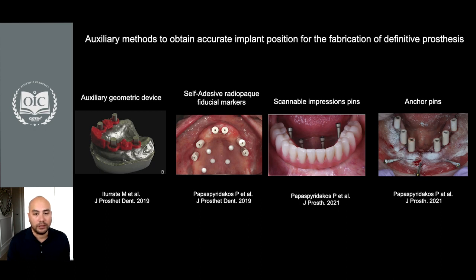Now, all these techniques are being reported in the literature. However, I think they all have limitations, because they need to be integrated virtually, which is not very convenient for the technician. We want a system that is already virtually in the software.